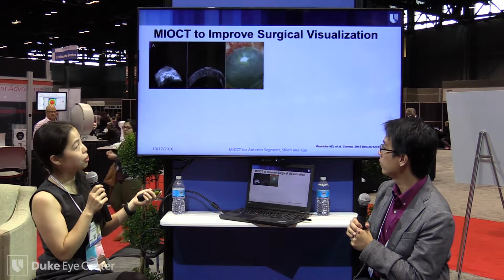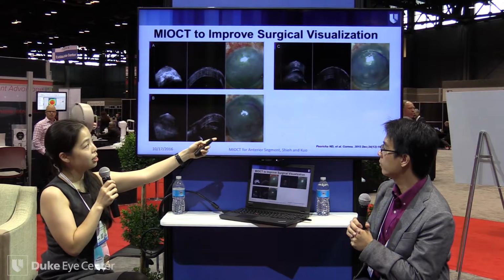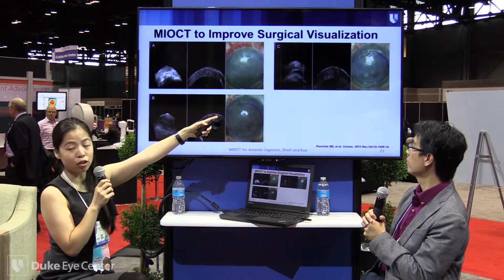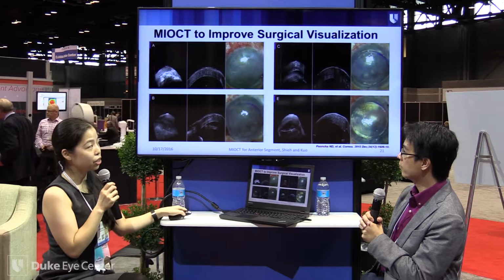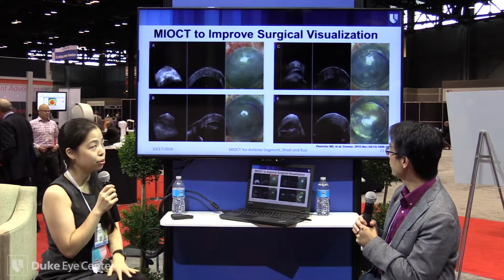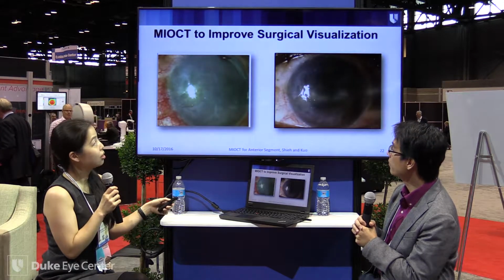In this other example, we're able to see the graft once it's been inserted. And over here in that far corner, you can see that there's actually fluid between the graft and the host, which was not possible to visualize through the microscope. And so with the use of OCT, we're able to remove that interface fluid and therefore improve the patient's surgical outcome.